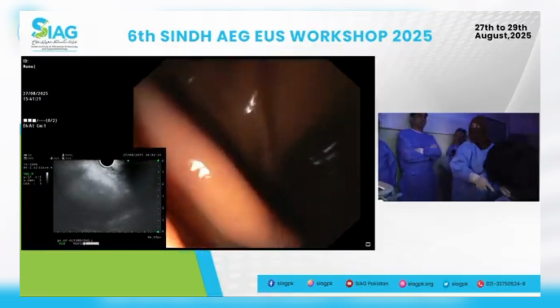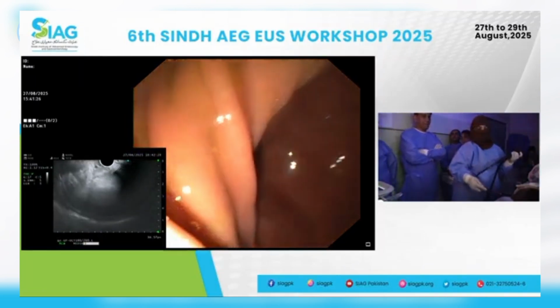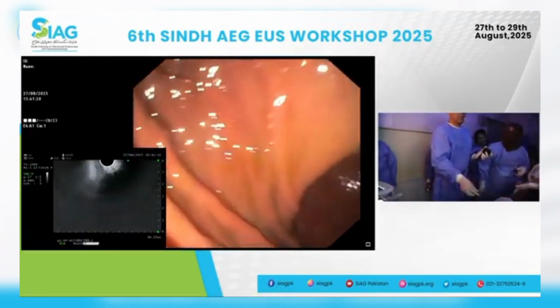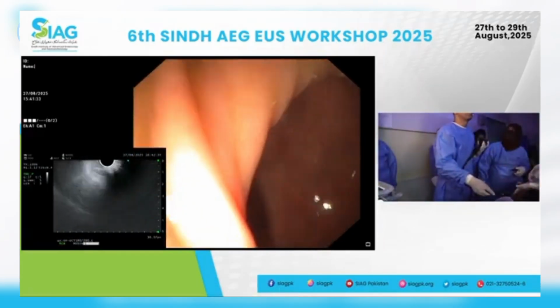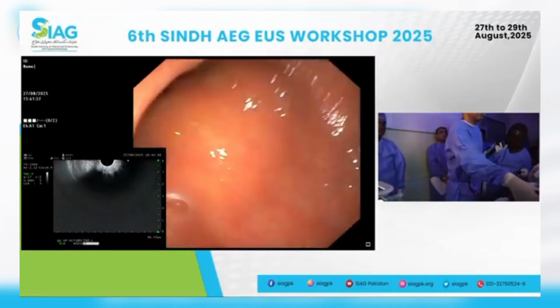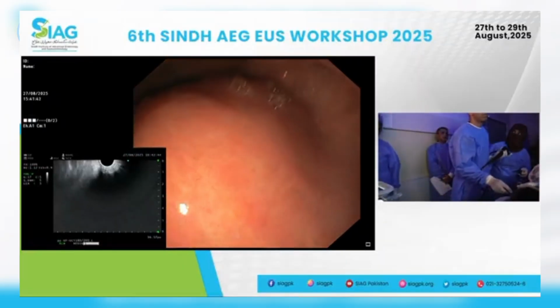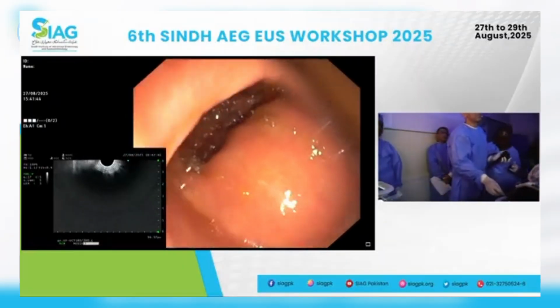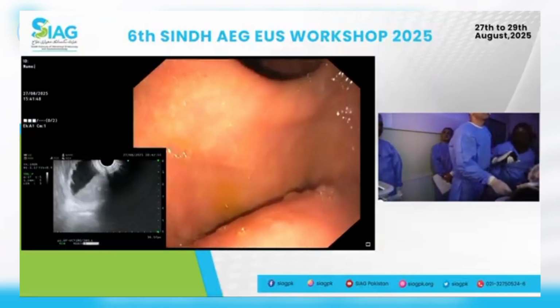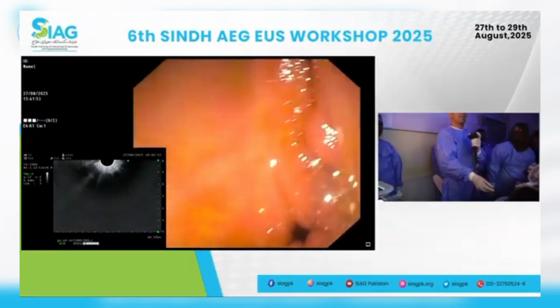Tip up, tip up, tip up. Nice. Let's have a look. Oh no, I agree. I think there is a bit of a resistance. The neck, throw forward. Good. Yeah, no, I think it is. There was a slight.